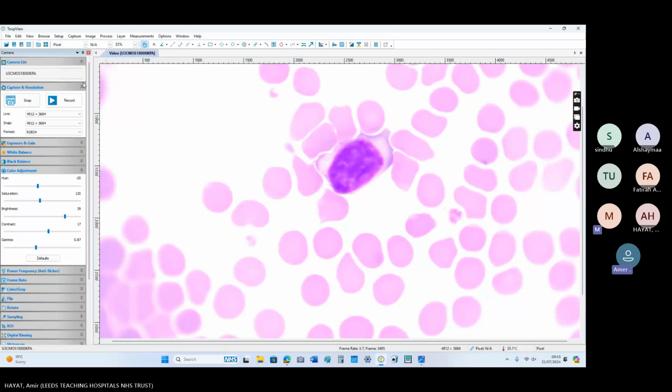Do you not advise the heterophile antibodies or monospot test, or we just say, okay, rule out? Yes, so this will be the next question, what investigation you will do. But to complete the report, you will write your findings. You will mention the most probable consistency, like this film is consistent with, and a suggestion of what investigation you would do next.